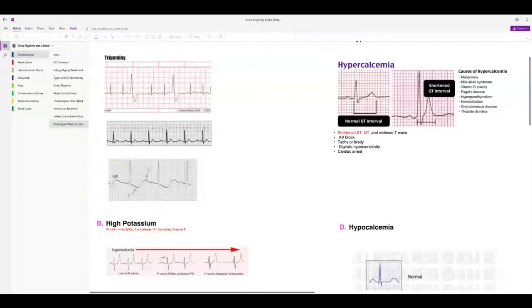But we're keeping it real simple, right? If you work in a cardiologist's office, don't start talking to them, because I'm not teaching you how to read an ECG. I'm teaching you how to read a rhythm strip. Reading an EKG is a totally different skill set. This is just one view. We only have to really deal with one view of the rhythm strip. Do you have any questions?